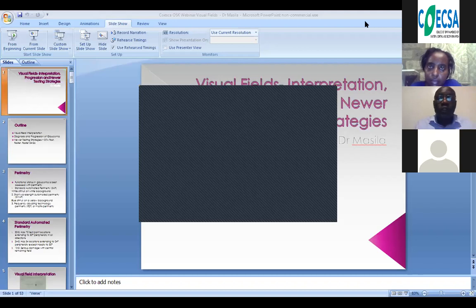Okay. The other thing I have to say is that you might be frustrated with some of the older machines, which will not show some of these things like the Esterman or some of these analyses that Masila has talked about: event analysis, trend analysis, MD analysis, the overview. I think the machines before 207 don't have some of these things.